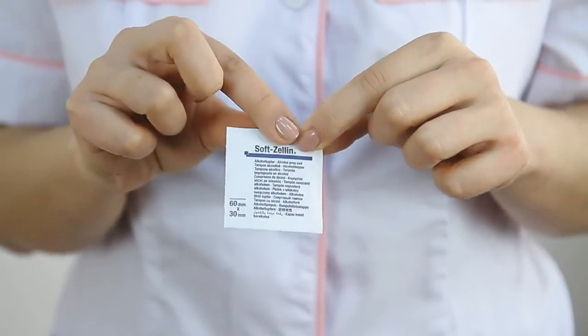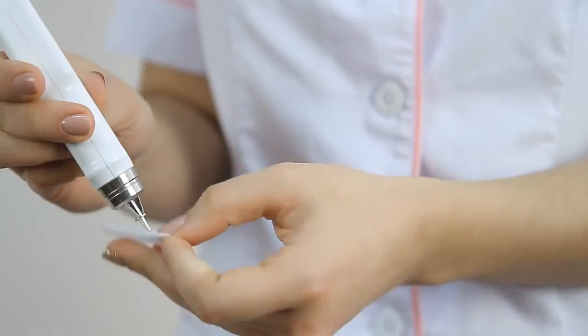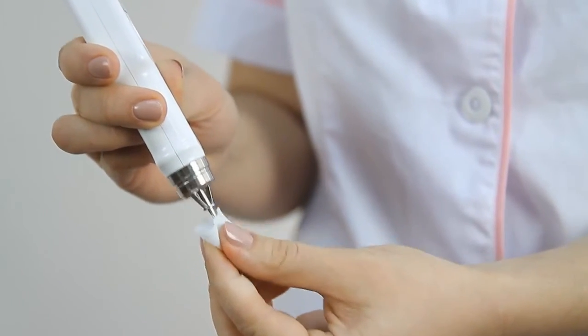Getting ready for use. First of all, take the protective cap off. Please make sure to disinfect the protective ring and vibrator rod before the first use of the tonometer and before each new patient. Please avoid penetration of disinfectant inside the device.